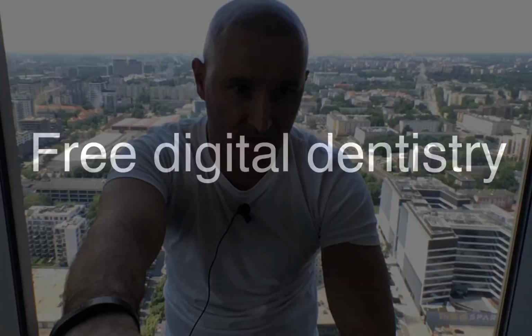Today I will try to tell you something about digital dentistry again, despite that I promised that next time will be about laser dentistry, but you guys had more questions and more interest about digital dentistry. You asked me what is the better way to enter the digital world of dentistry. You had some problems and questions about what you need to start.